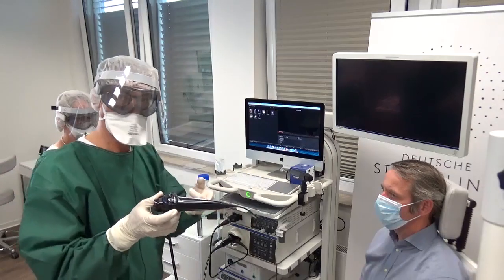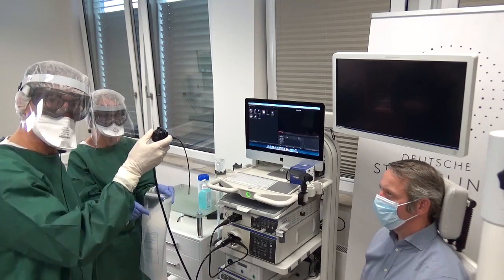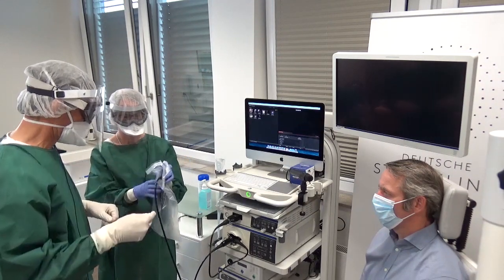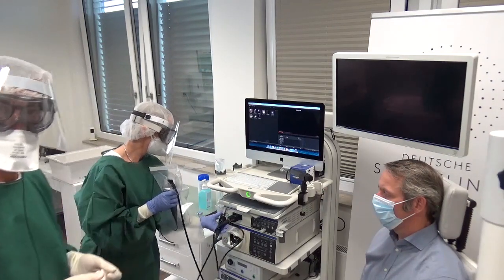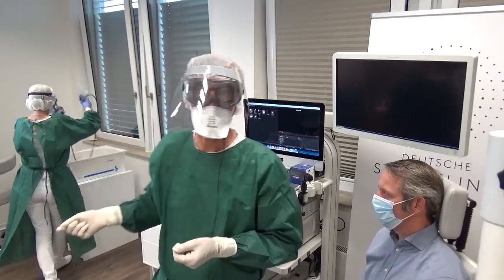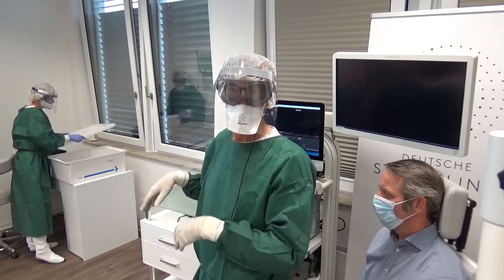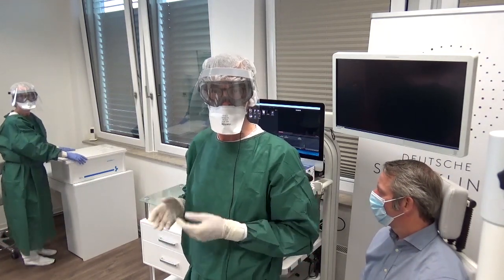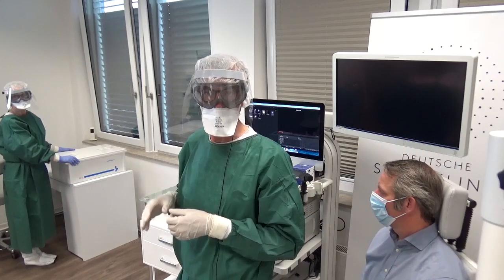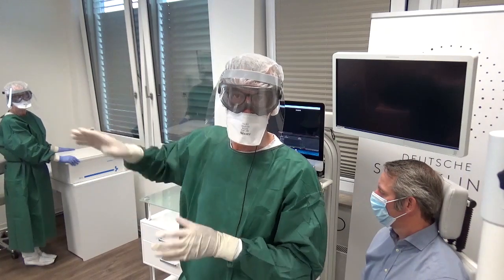Now I have to hand this over so that it is put to the cleaning process. I will put it into this bag, and then the assistant takes the endoscope and puts it into a big bin. The bin has to be covered and then transported outside of the room, and then the normal process of cleaning the flexible endoscope takes place. There's no difference from the otherwise cleaning process — from now on, the cleaning is a normal process.